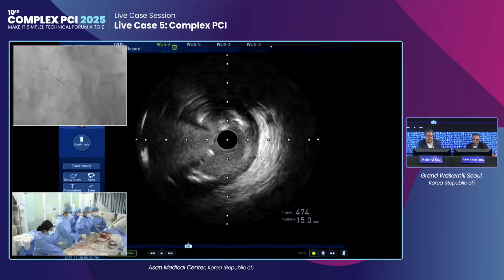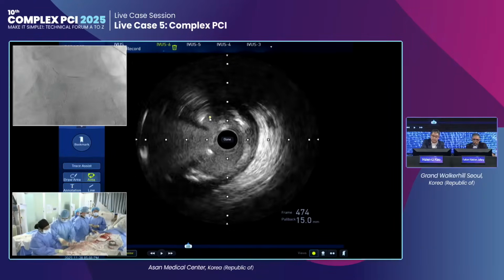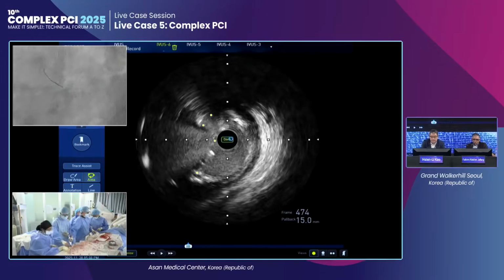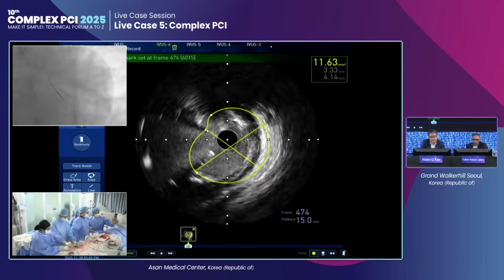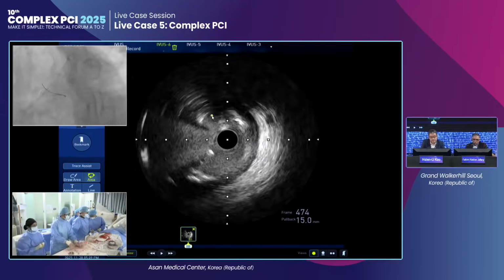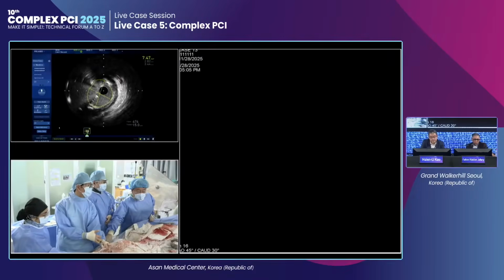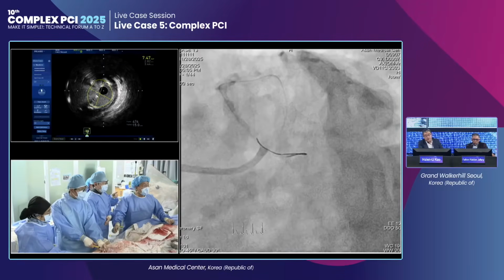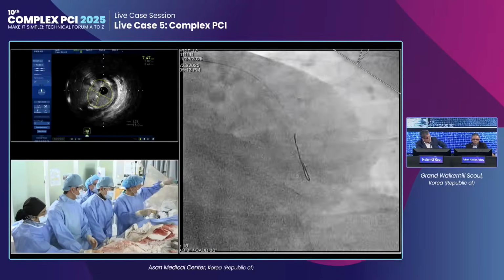What is the area? We call this optical distortion, because there is such a mismatch between the ostium and the vessel distally that our eyes get distorted and perceive what is small as too small. It's already a little bit better if the stent is more into the left main.